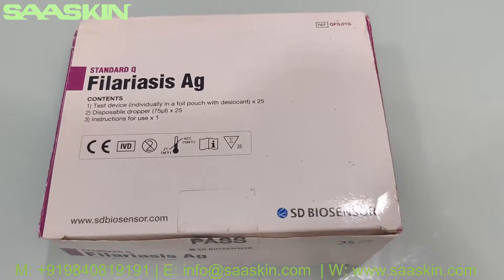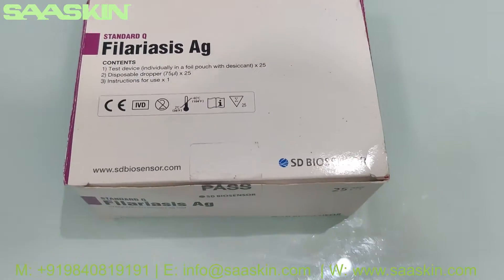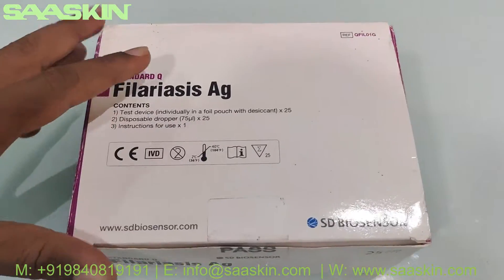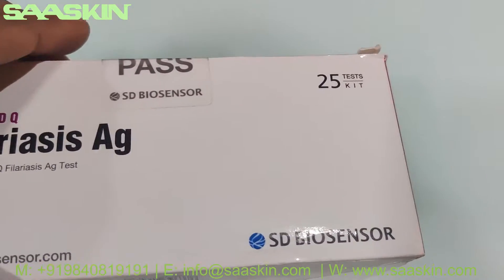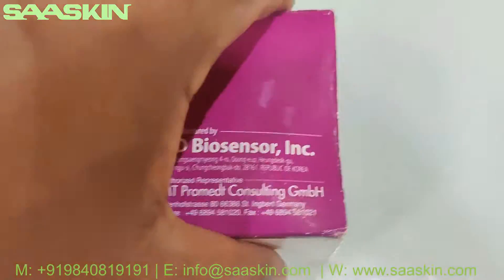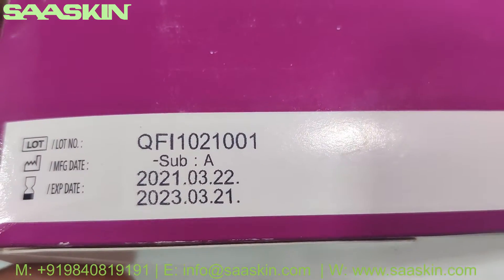Hello everybody, today I'm going to unbox the SD BIOS sensor Standard Q Phylaris antigen test kit. This is a completely CE IVD certified product. Let me show you around the box — on the sides here you can see it is manufactured in Korea.